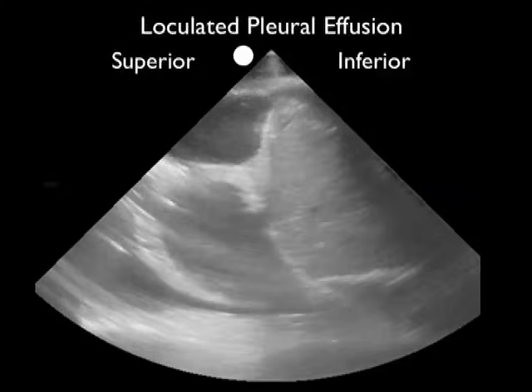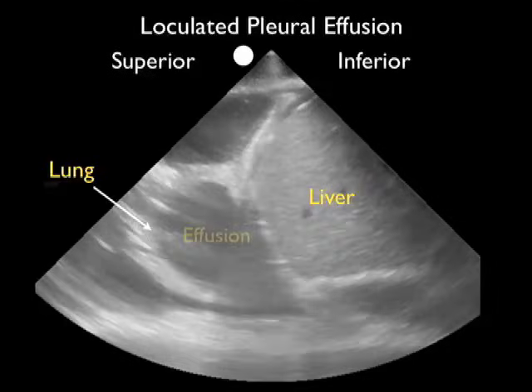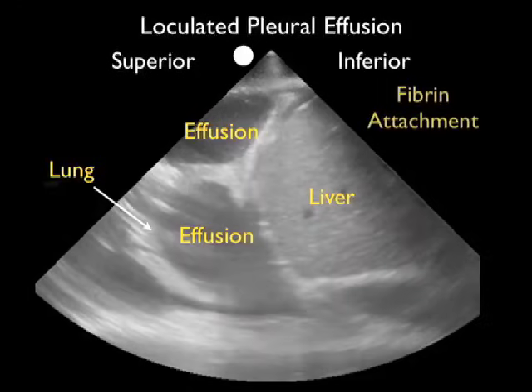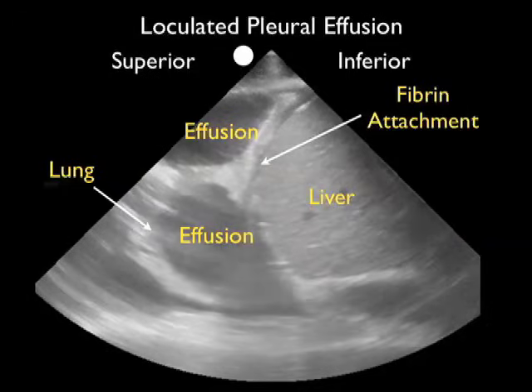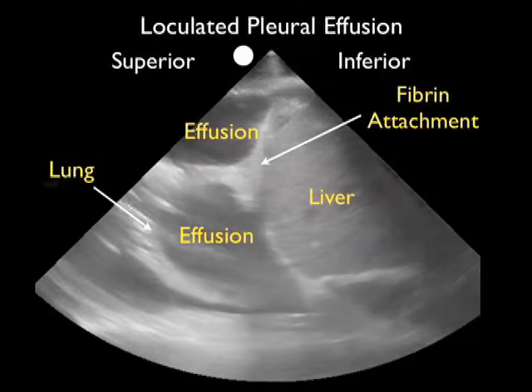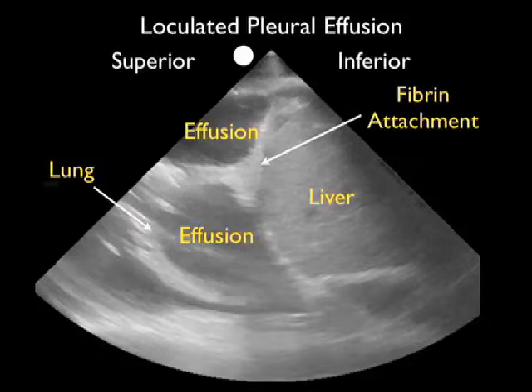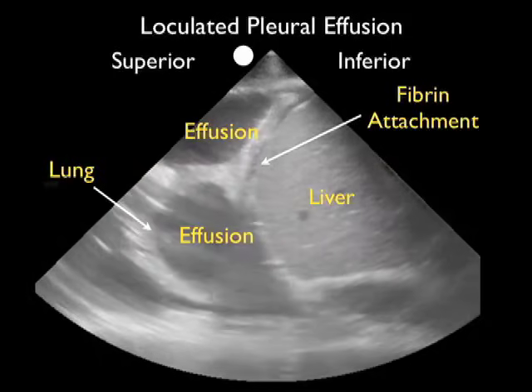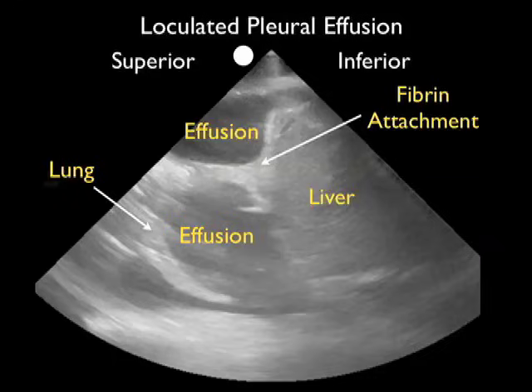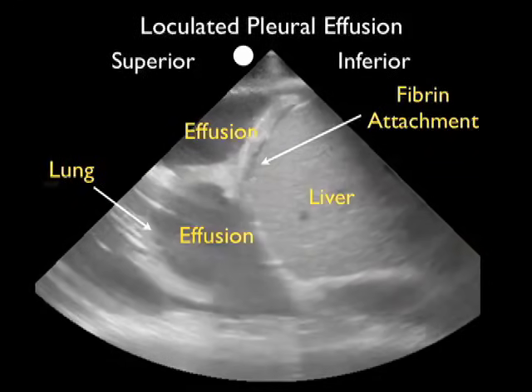Just to emphasize the point that it's very important to look with sonography prior to performance of a thoracentesis procedure — this pleural effusion is taken from the right chest. We see the liver towards the inferior aspect of the patient, and we note above the diaphragm, which is moving up and down as the patient breathes, the presence of a dark or anechoic fluid collection. But we also see lung within the pleural effusion and a fibrinous attachment that attaches the lung down to the diaphragm. So this could be a potentially complicated thoracentesis, as a needle going into that chest cavity could be pushed by that fibrinous attachment up into the lung causing a pneumothorax.